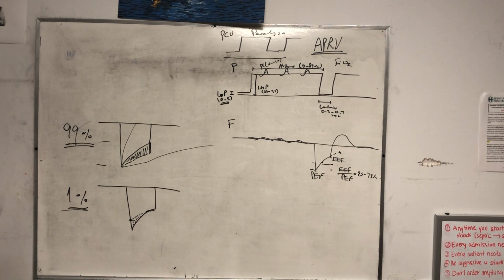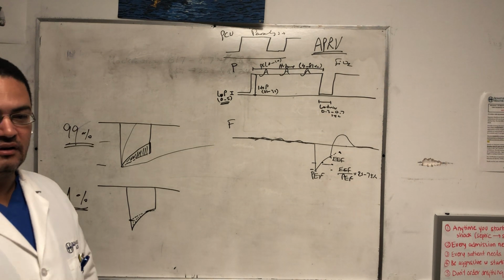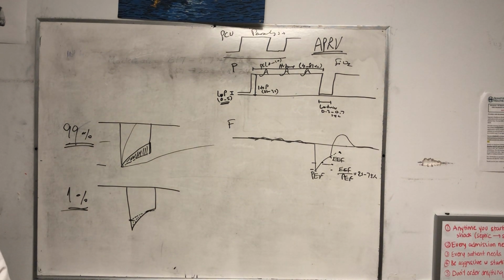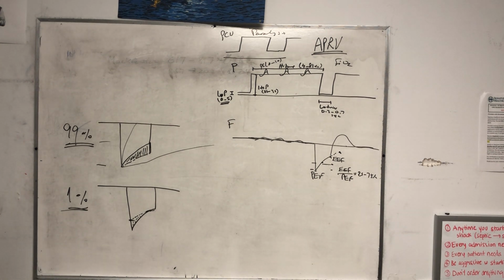So the typical question is, can we use APRV in COPD patients? Because by definition, the low time is very short, and it's not enough for COPD patients to exhale fully, right? So yes, you can, or you should actually. That's another claim to fame for this mode.